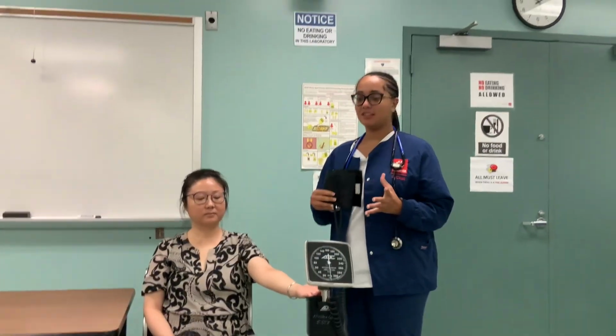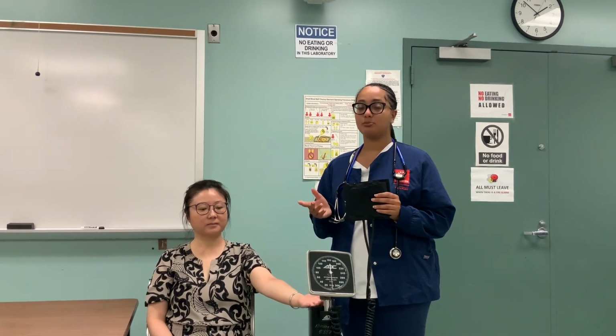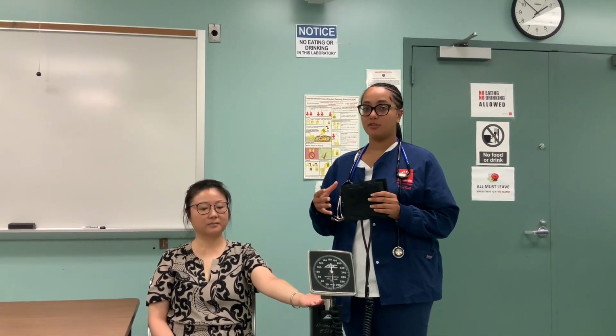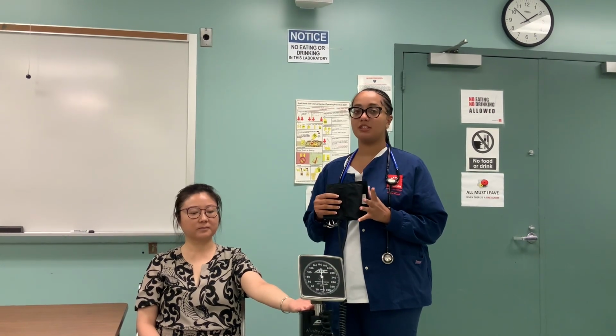Comfortable position, you want to make sure you're using the right cuff. So you want to make sure that it's not too big, because if it's too big, the blood pressure is going to be really low, and if it's too small, the blood pressure is going to be really high.